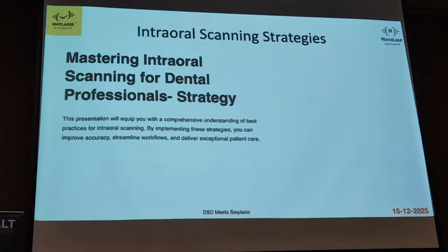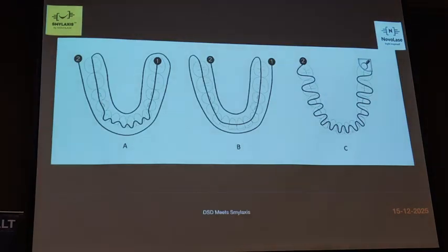And if you want to know about intraoral scanning, just like impressions, the impression done by madam and the other doctor may be different, right? The same thing can happen with the intraoral scanner also. So that is why you should know how to do a proper scanning. So how to do proper scanning? You just follow the catalog that they supply from the company.